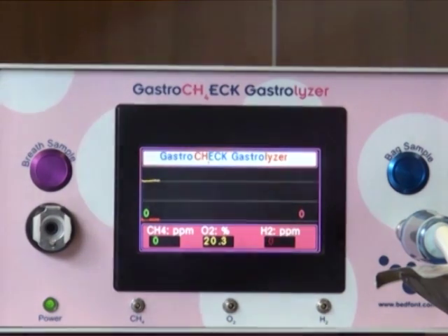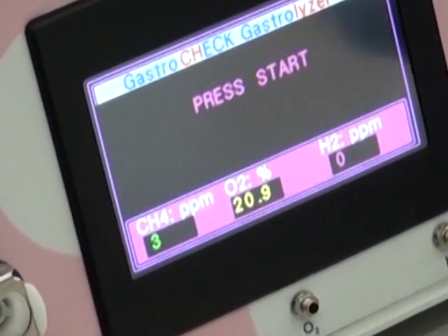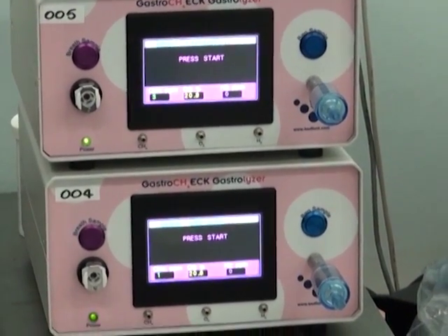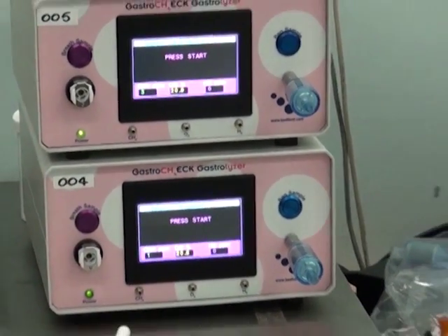An oxygen reading is taken to motivate patients into providing an end tidal sample. If they are unable to do this, the Gastrocheck will automatically correct the reading. Clinical papers have cited that there are around 35% of non-hydrogen producers but in fact methane producers instead, and the Gastrocheck Gastrolyzer can help aid with a more accurate diagnosis.